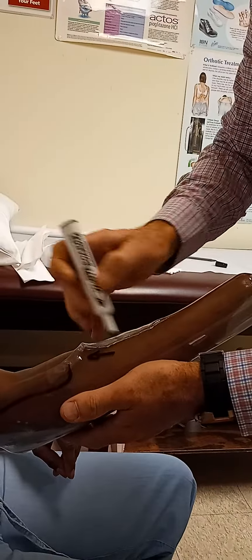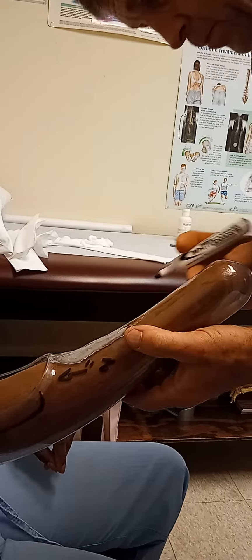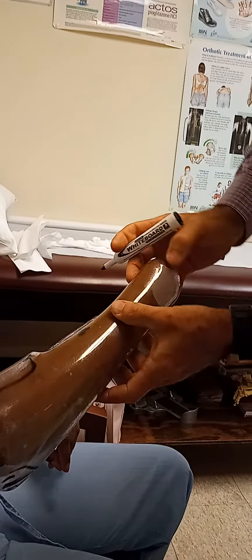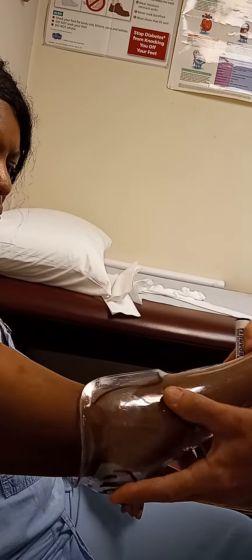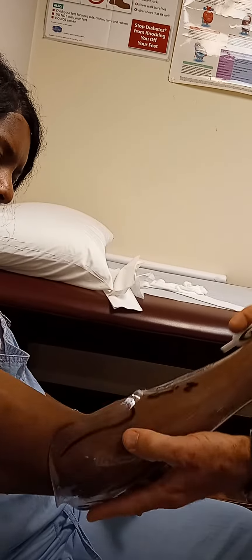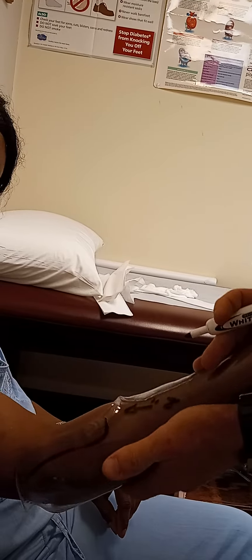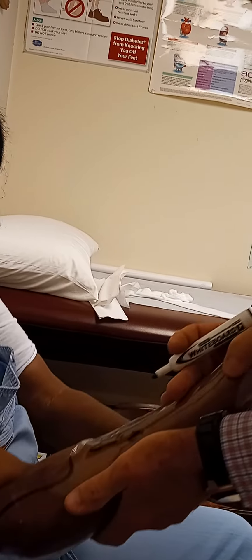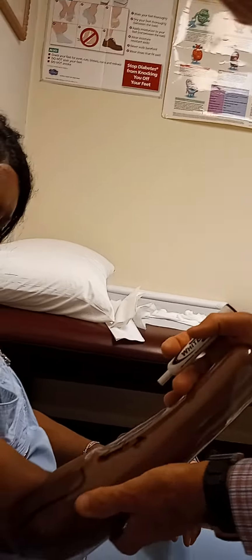Through here. I'm going to go heat this in just a minute and push that in. Does this hurt at all? Bother you at all right there on the bone? Kind of twist a couple times there. I want you to push toward me. Nowhere hurting you, bothering you like that? How about when you twist a little bit to the right? Right there it did. That's what I want to find out. Where's that at?